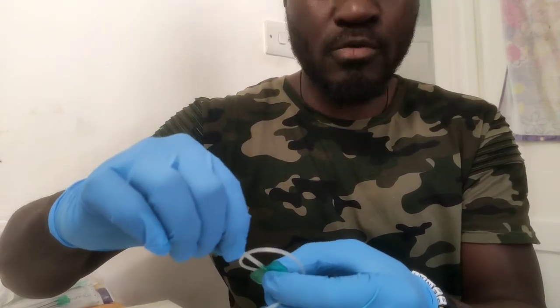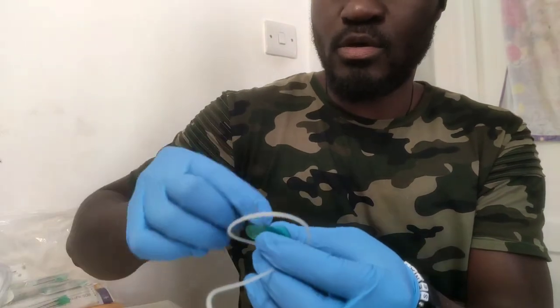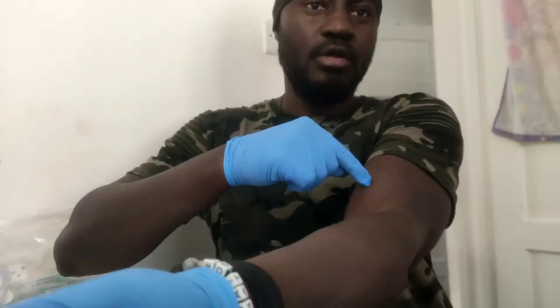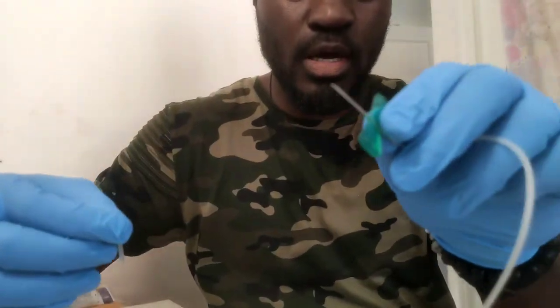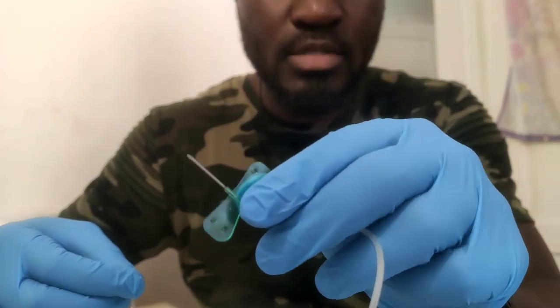It could be painful, but just pull it off. Right. Find my vein here somewhere. But before then, just to show you how — I don't know if you can see, but that's it.